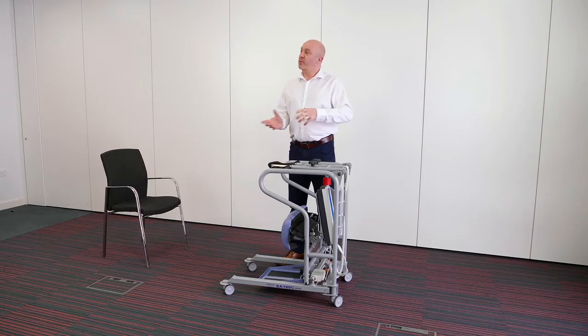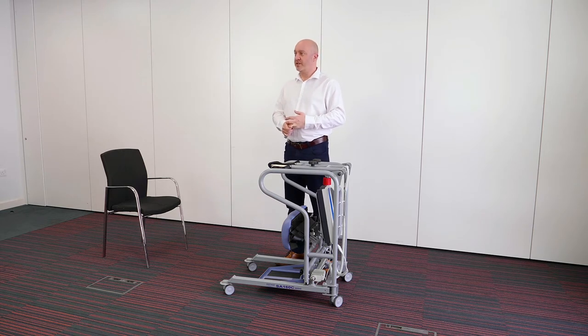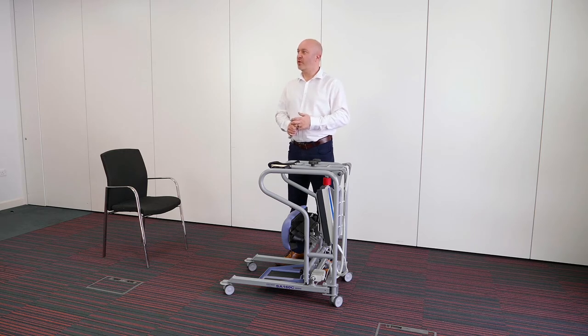I'll do that with myself first of all, and then I've got a colleague standing by to be my client, so we can go through how I would fit the slings around them and then stand them up. We'll be using a standing sling for full support standing, and then we'll be using a transport sling or a dual access toileting style sling for the transport option if you're going to move a bit further on the unit.